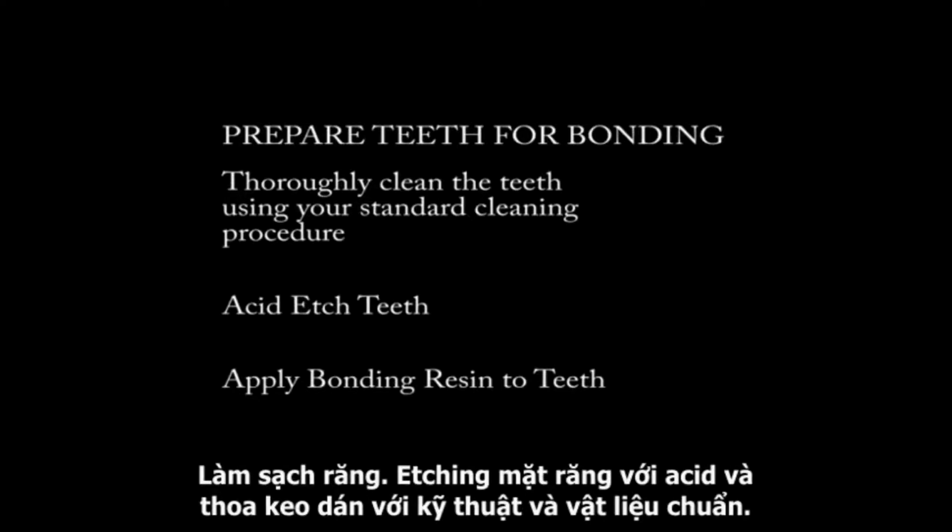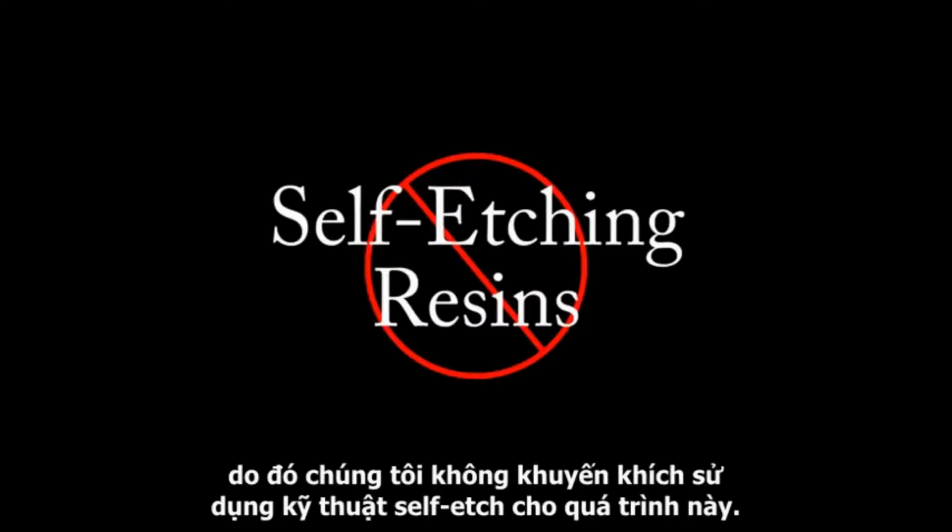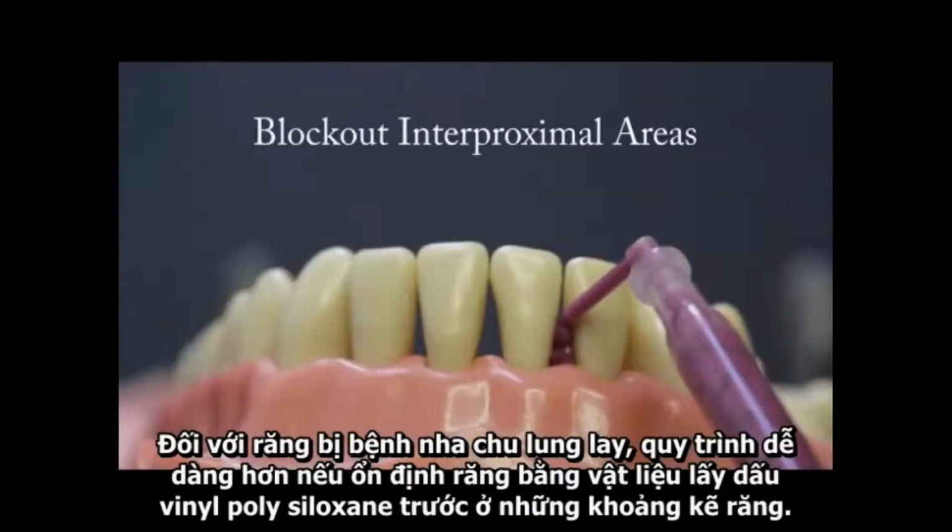Clean the teeth and prepare the teeth for bonding. Clean, acid etch the teeth, and apply the bonding adhesive using your standard bonding technique and materials. Please note, since there is no clinical evidence supporting the use of self-etching resins for this type of retentive bonding, we do not recommend using self-etching resins for this procedure.